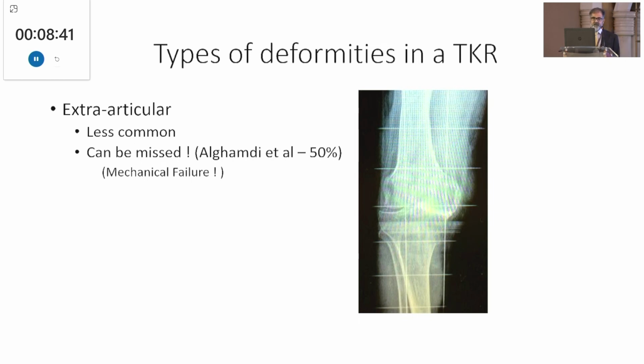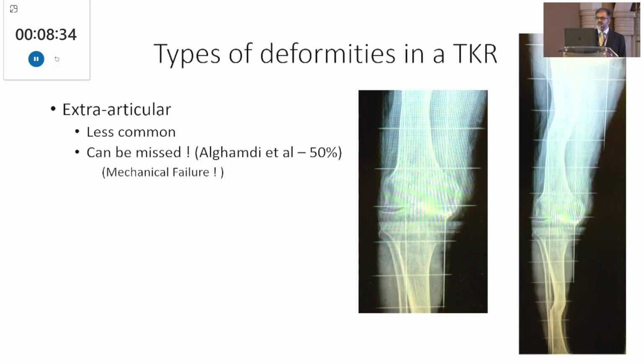Now, this is one of my cases from a little while ago. And sorry for the screenshot, it's not really clear. But if you do the full leg view, it's a whole different story.